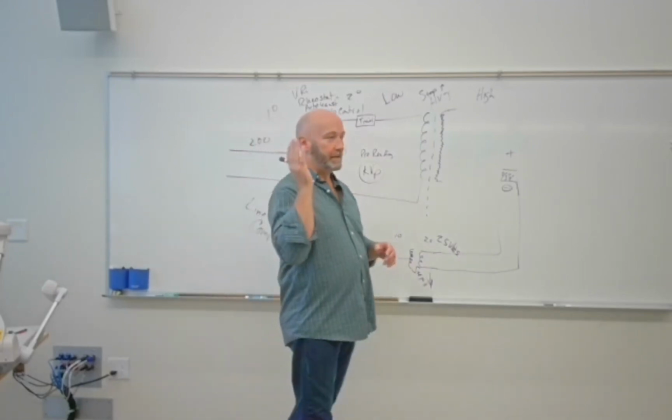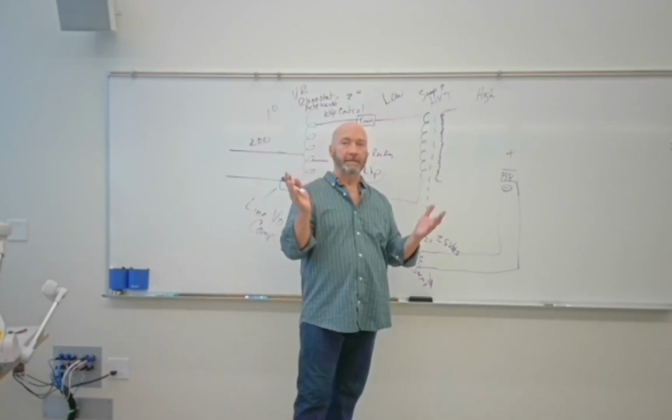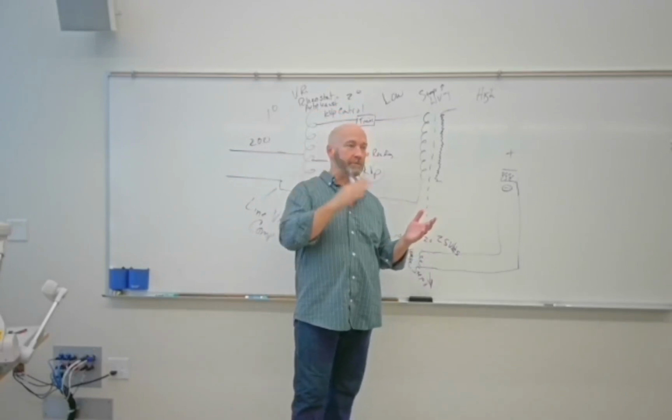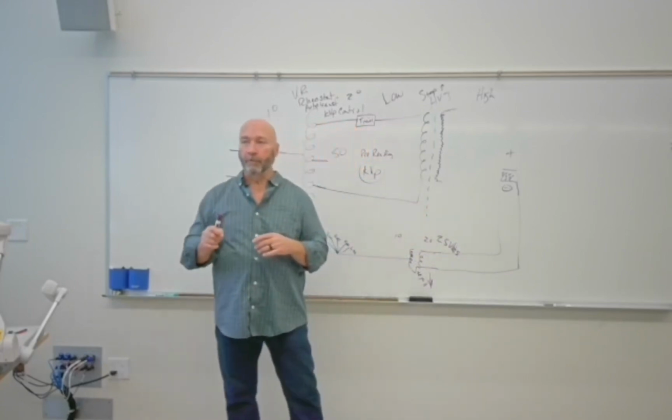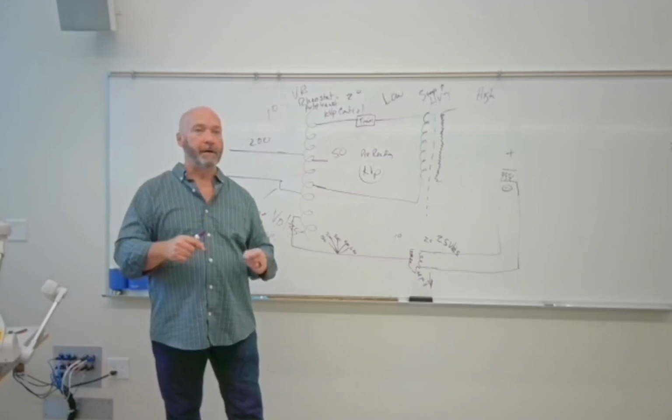As the exposure progresses, that mA station naturally drops. The reason for that is because what they need is the lowest time possible.